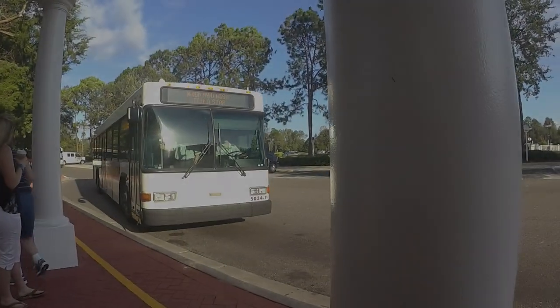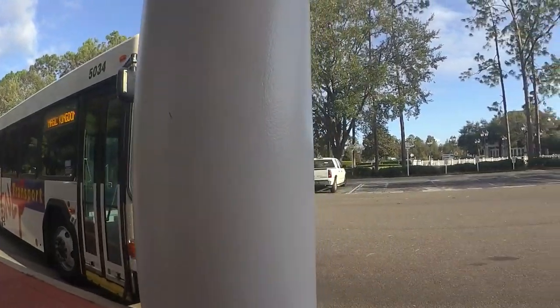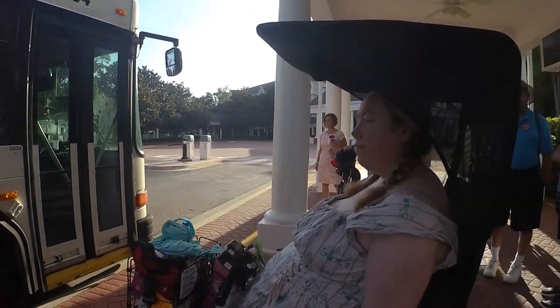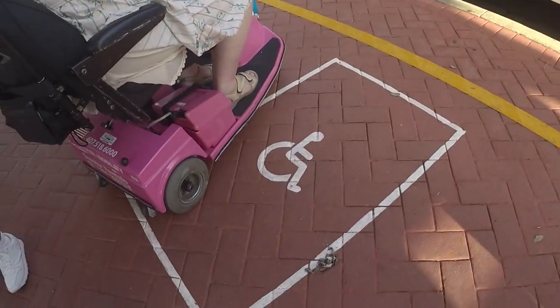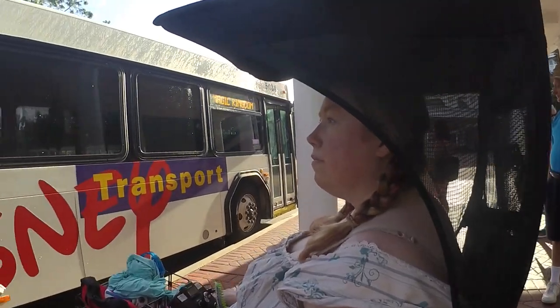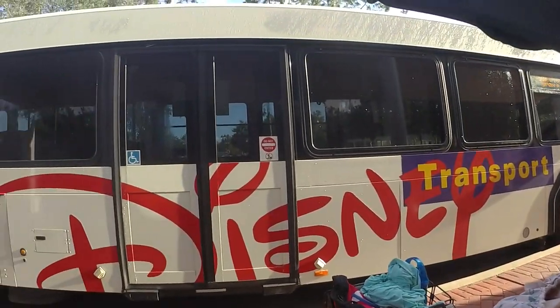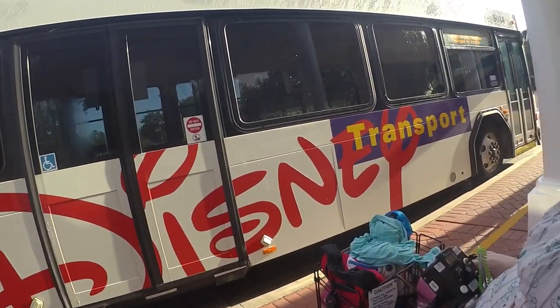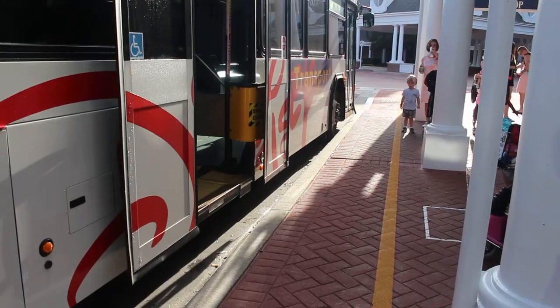Hi, this is Kelly from Roll the World, and today we're talking about taking your scooter on the bus. You're going to want to park and wait where you see the handicap symbol on the sidewalk. The bus driver is going to unload the bus and let able-bodied guests board before he will lower the ramp for you.